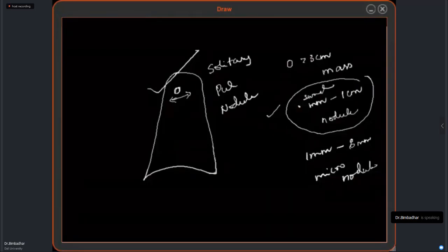Generally, we do not actually do it like this. Radiology has provided better information. Tuberculosis radiographic features are much more specific. By the end of this chapter, you will understand how to differentiate and how to confirm tuberculosis.